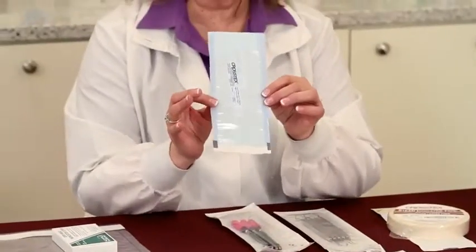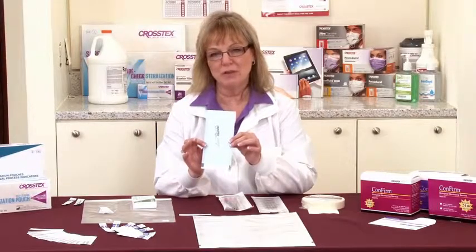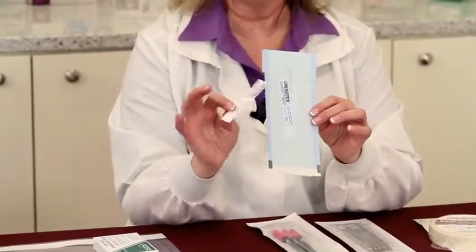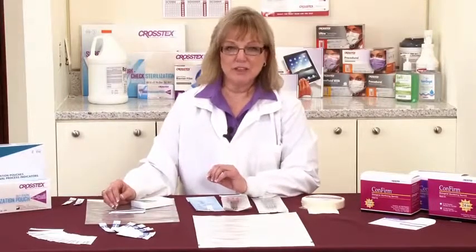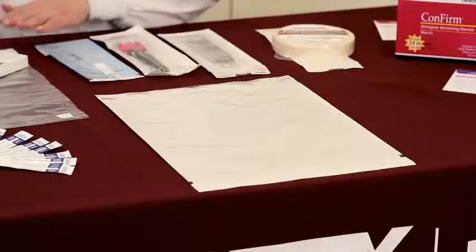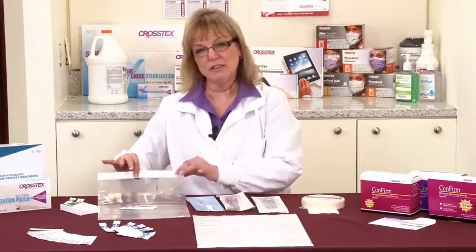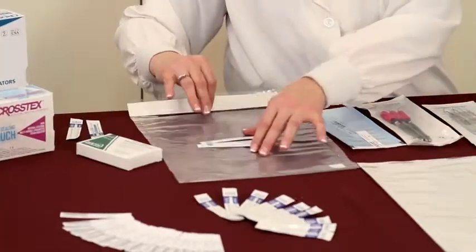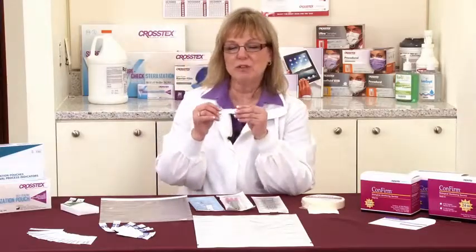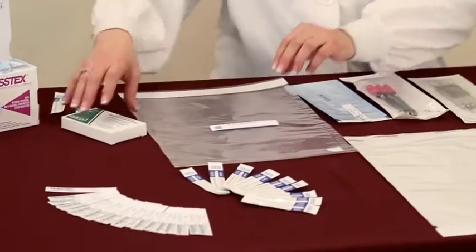If a pouch does not have a built-in chemical indicator, such as the SureCheck does, then we have to insert a separate chemical indicator, which can be used in the form of strips for those offices that have a dry heat sterilizer. While a paper pouch would not be appropriate in a dry heat sterilizer due to the extended time of sterilization as well as the higher temperatures, Crosstex does have options for a dry heat sterilizer in the all-plastic bag that is self-sealing. But because it does not have built-in internal and external indicators, a separate chemical indicator has to be used. For dry heat, a Class 3, which registers the parameter of heat, would be placed inside the pouch to assure sterility.